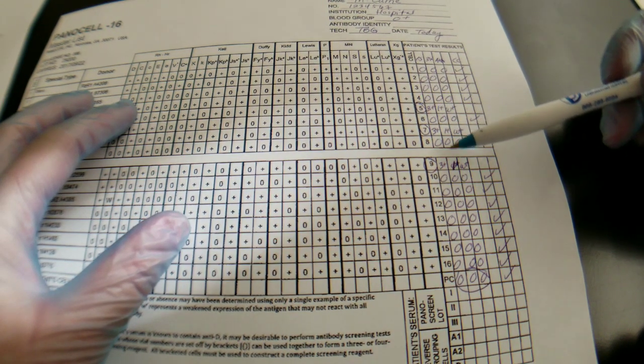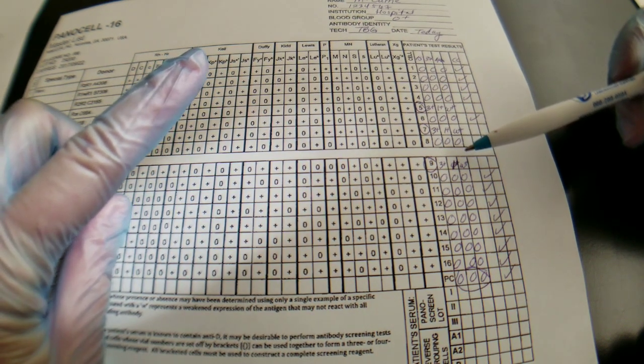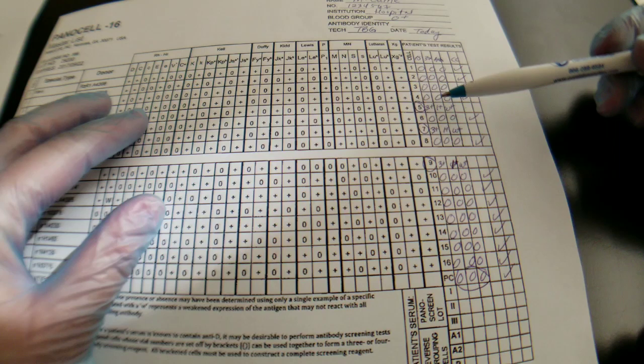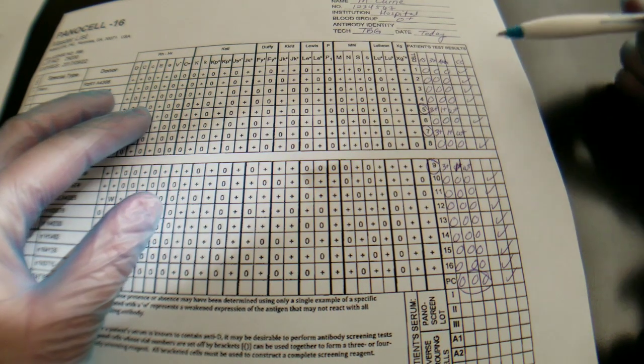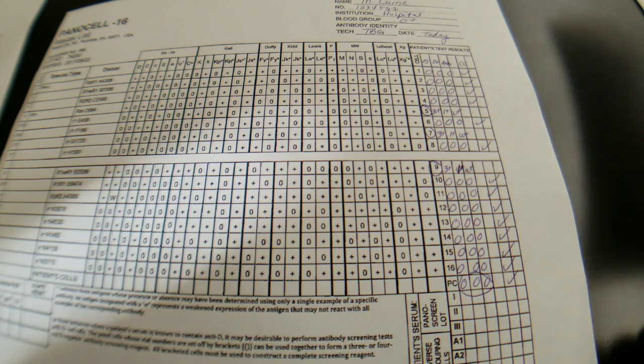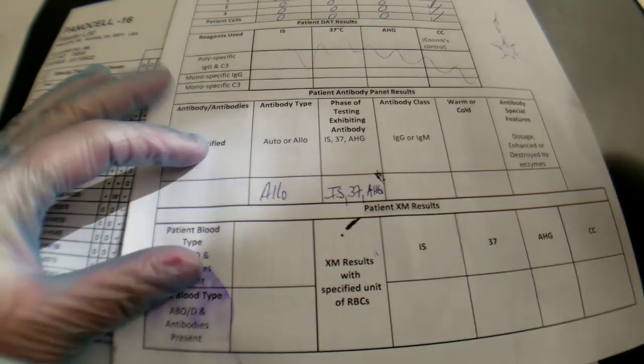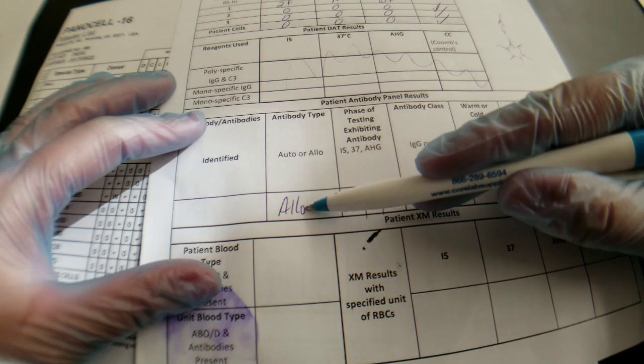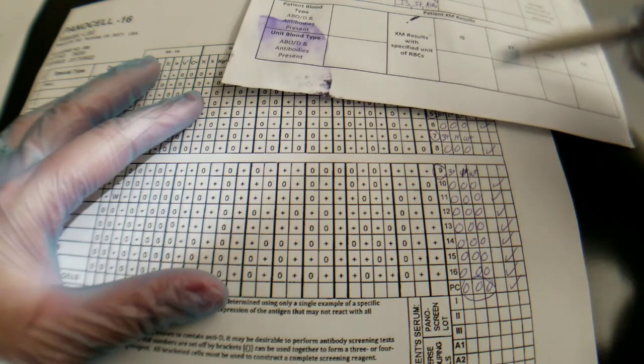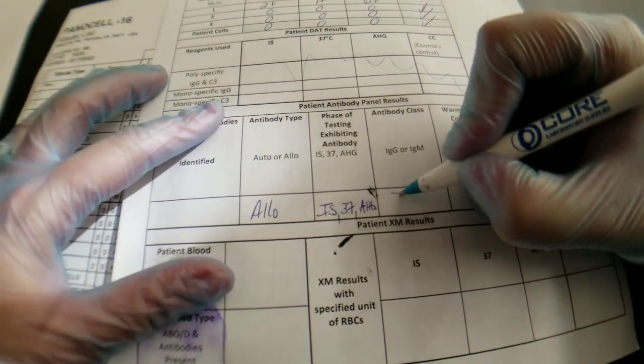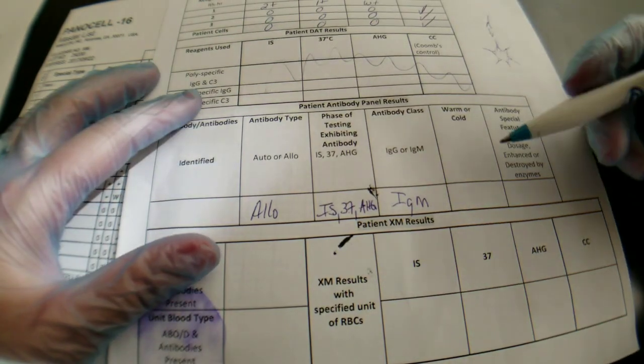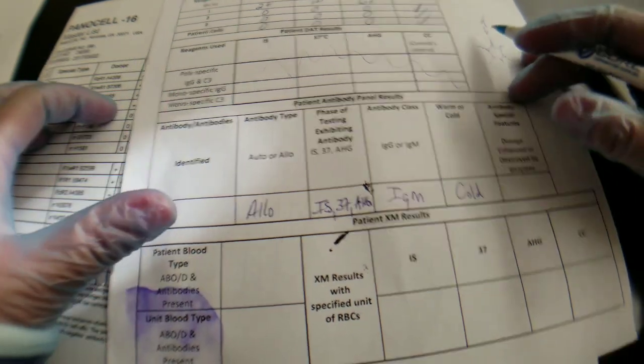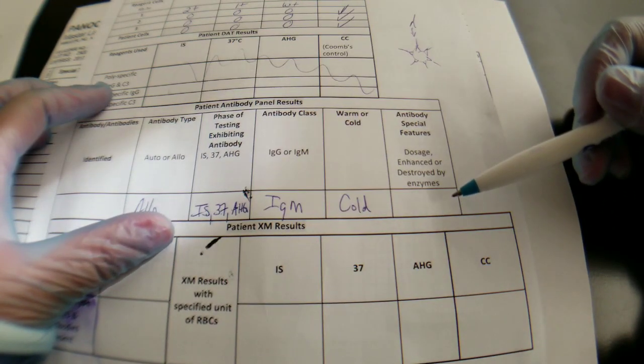Since they all seem to match, we're assuming that there is one antibody here. And since it reacted most profoundly in the immediate spin phase, I'm going to say that it's an IgM. So it looks like heating it up makes it go away. That is not very technical, but that is what you're looking at. It reacted at all three phases. We're assuming it's an allo antibody because of the negative auto control, and then it's going to be IgM because the higher reactivity is in the immediate spin. That would be considered a cold antibody just because it's reacting at room temperature.